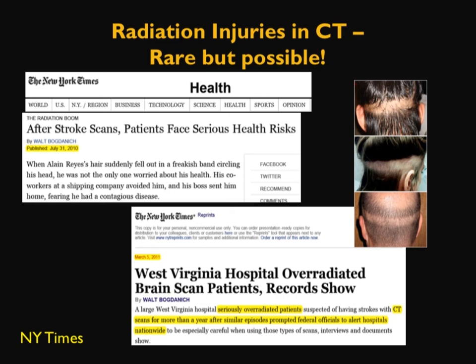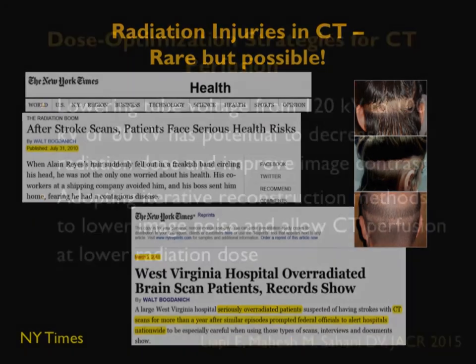All clinics are required to evaluate their protocols to make sure that their CT perfusion protocol does not have the same problem. However, even after a year, it was brought to attention that one hospital still continued to do the same type of procedure, resulting in hair loss.